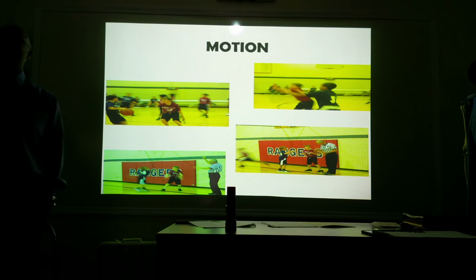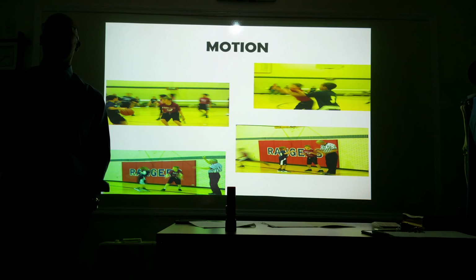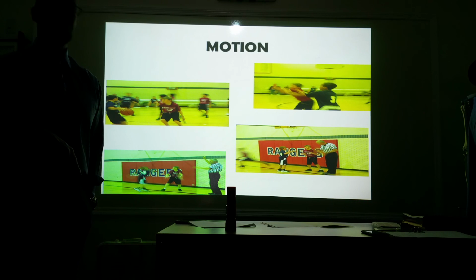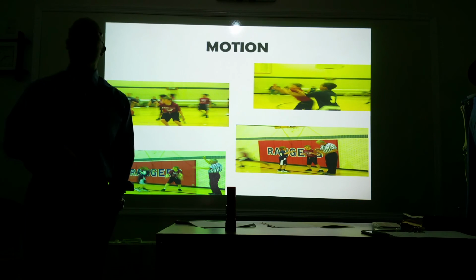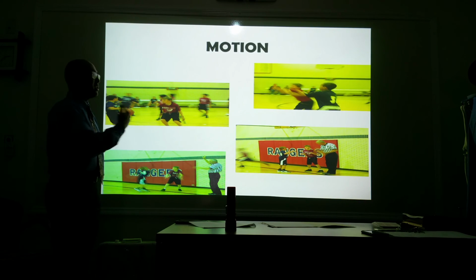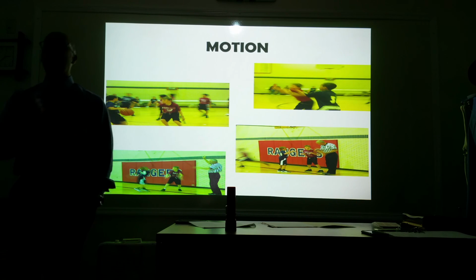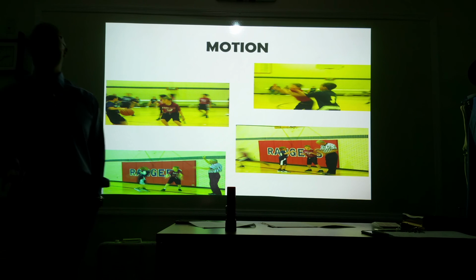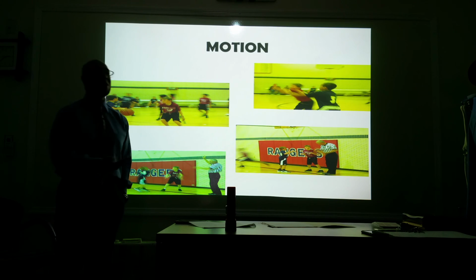All right. Lastly, motion. Do we want motion? We don't want motion. Or do we? This is fluoroscopy. So for the most part, we don't want motion. So how do we control motion? Because motion deteriorates our image, right? So how can we control that? Shorter time. What else can we do? I don't call it threatening, but communicate with your patient.